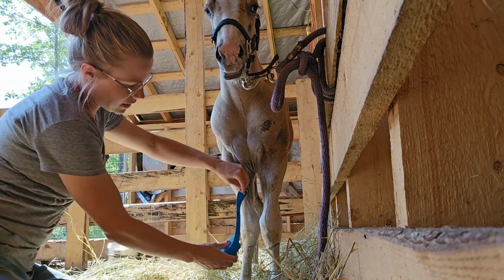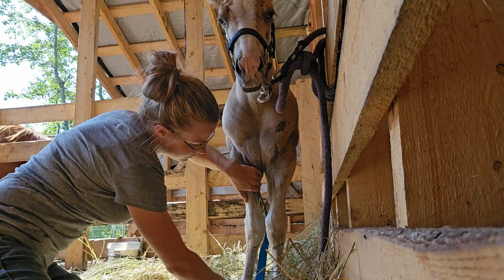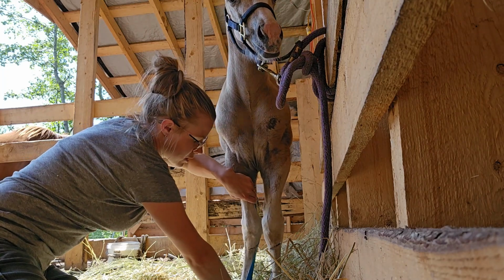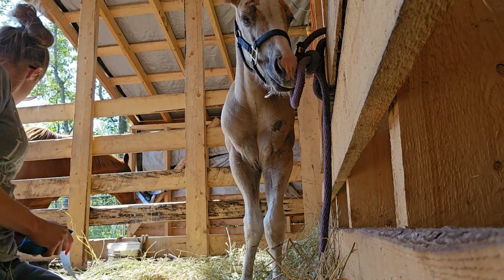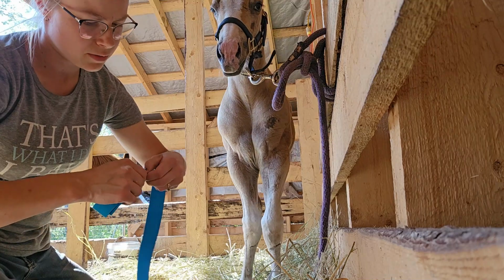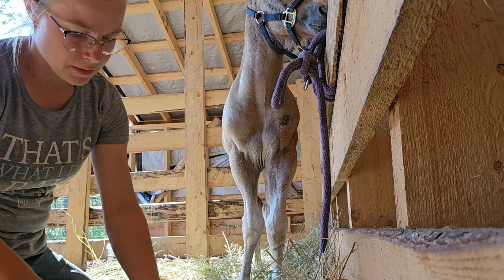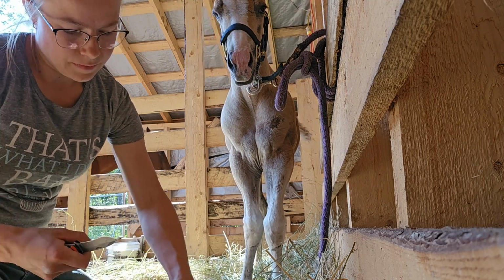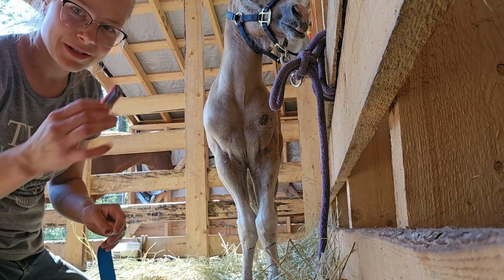I'm going to try to do this relatively quickly. I'm just going to measure this out, figure out where I need to cut it. I want it up above her knee, inside, and then all the way down to past her pastern. I'm going to cut it about there. Scissors would probably be a better option for this. Oh, no, it does not tear. It's just the paper. Oh boy. I may just try to speed this up for you guys because this might take me a while. Close that knife.